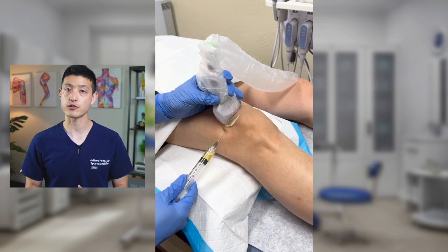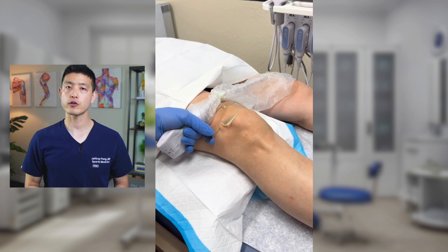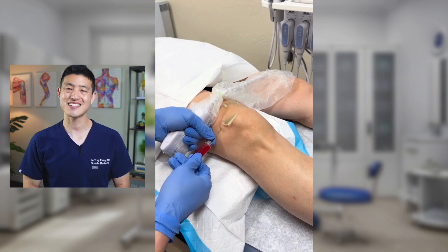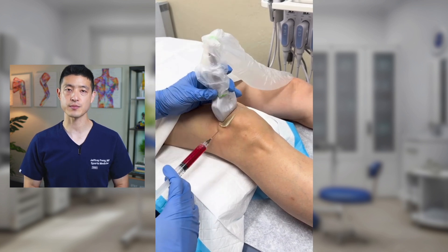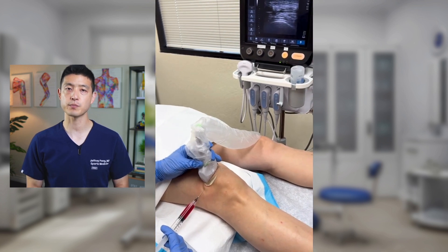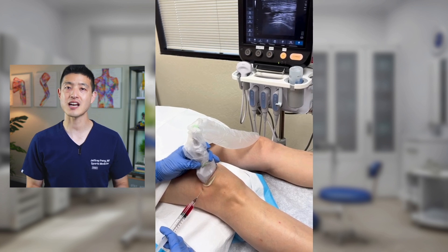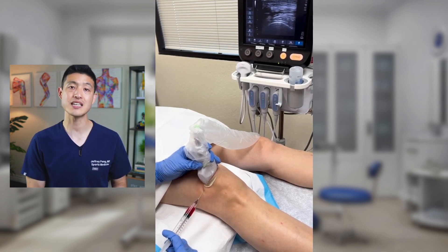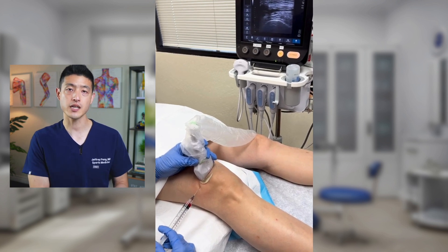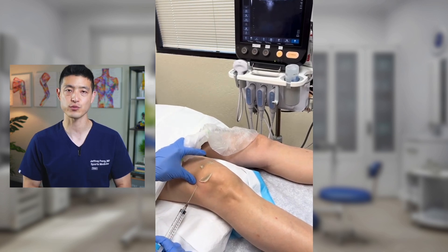The clear yellow color that you're seeing is typical for arthritis-related fluid. After aspirating out all the fluid, we switch to the PRP. For this patient, I'm putting in 8 cc's of platelet-rich plasma. You can see here that I'm using the ultrasound to confirm correct placement of the PRP inside the knee joint. I want to maintain visualization the entire time the medication is going into the knee. After the injection goes in, we're done — the whole thing from needle entry to aspiration of the joint fluid to the end of the injection took less than two minutes.